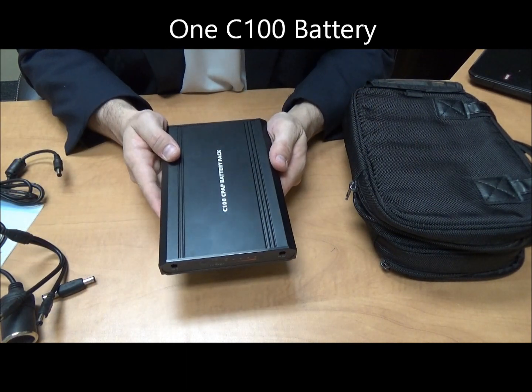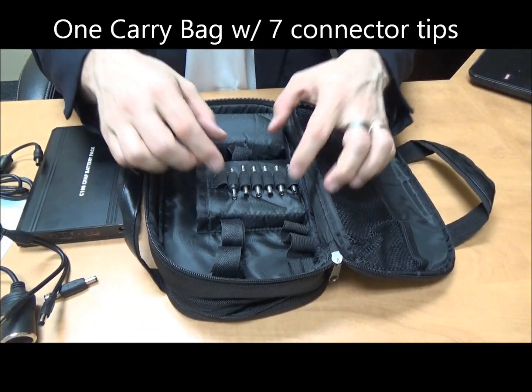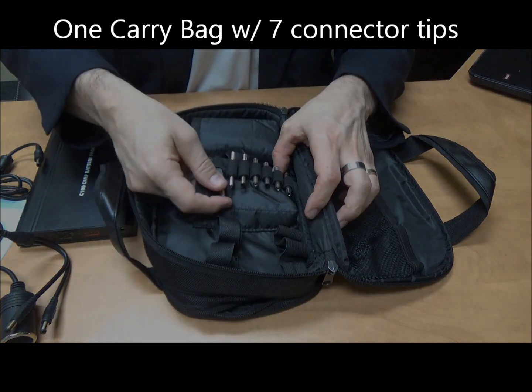Of course the battery itself, the bag, and seven connector tapes.